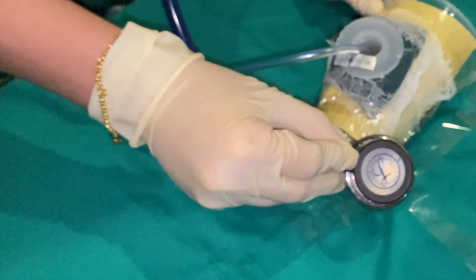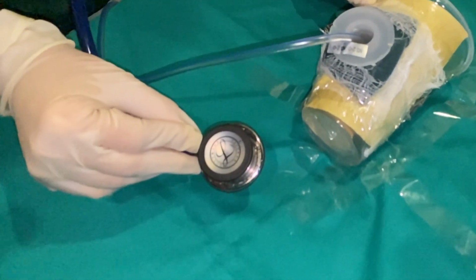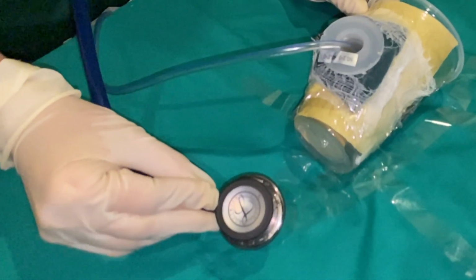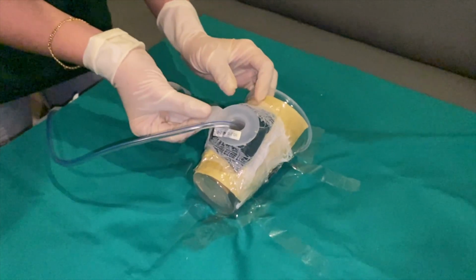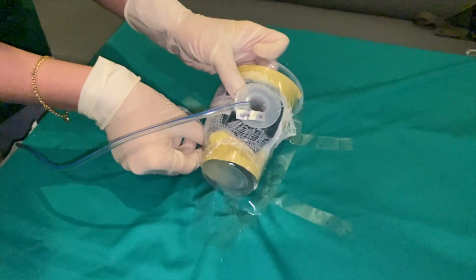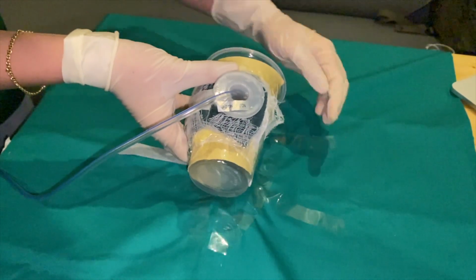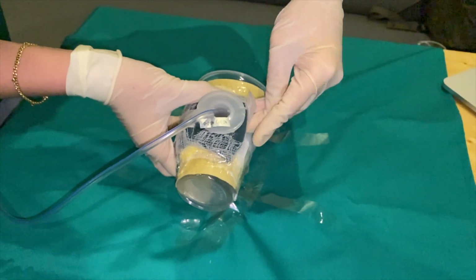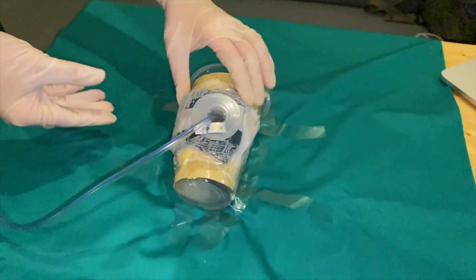Hand ventilate while confirming the correct placement of the tube within the trachea. Check for the expired PCO2, chest movement, and breath sounds. Secure the tracheostomy tube by threading tape through the fenestrations and flanges of the tube. Pass them around the neck and ensure it is tied with the neck flexed. The tie should be tight enough to admit no more than a single finger under the tape.